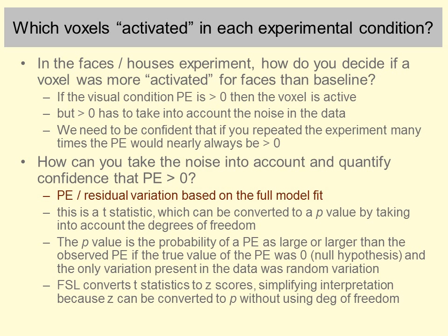If we consider the full time course, we have contributions to modelling that time course from all the different explanatory variables in the design matrix that have non-zero parameter estimates, and that produces the full model fit, which you could go and take a look at in FSLView by loading in filtered func for one of the examples and then taking a look at the full model fits.